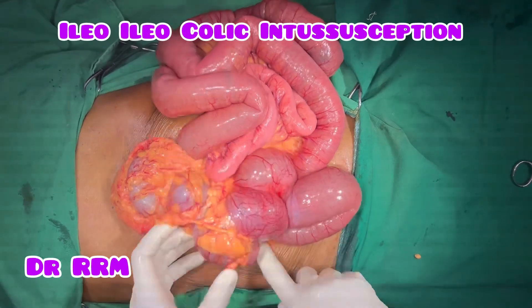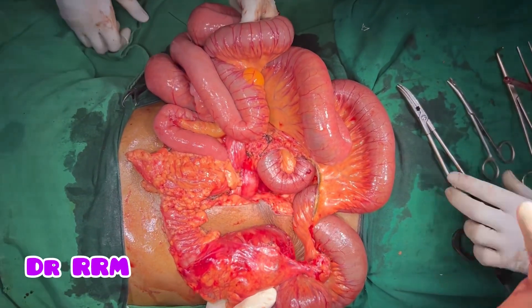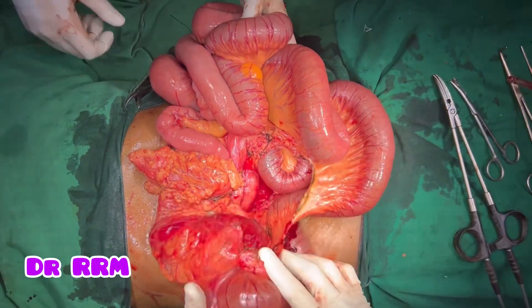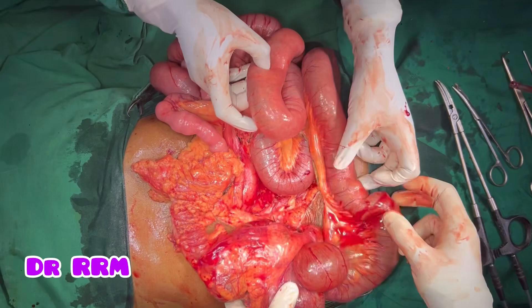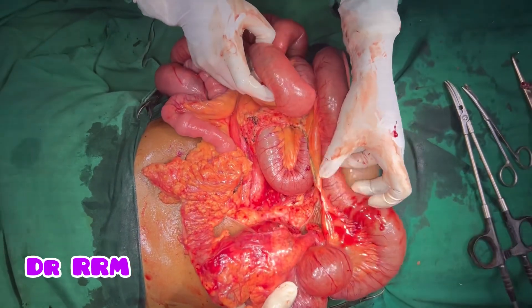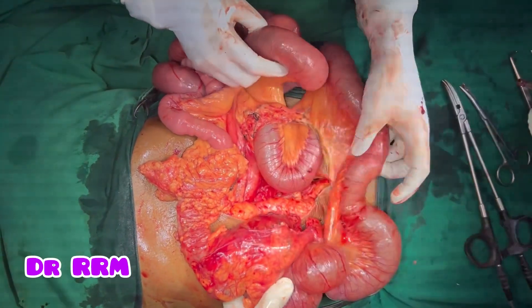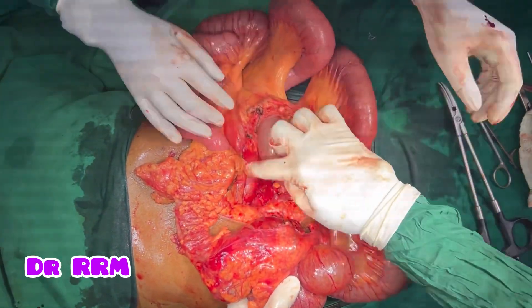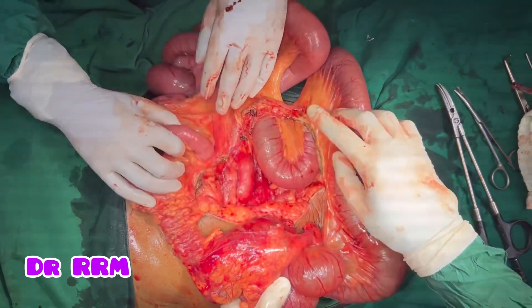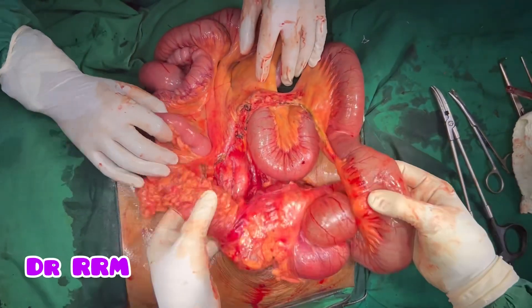You can see this is a right-sided growth. We have ligated three vessels — the ileocolic, right colic, and middle colic — all vessels ligated. We have now created the rent and are going to proceed with resection of this segment.